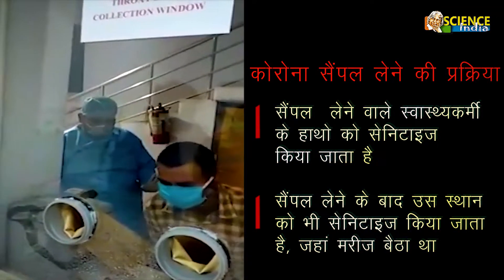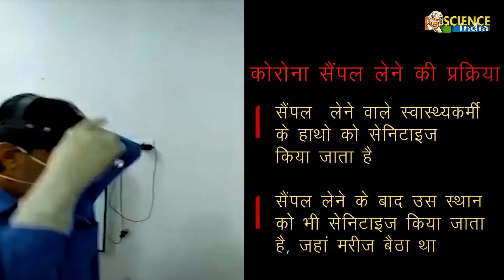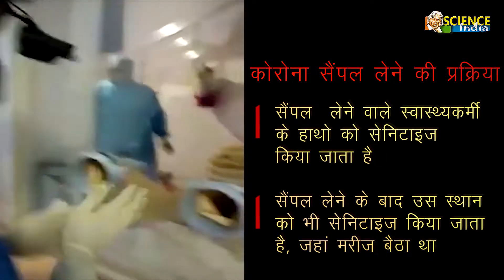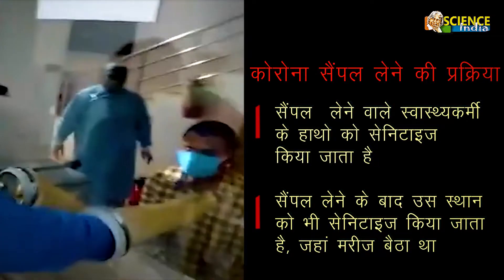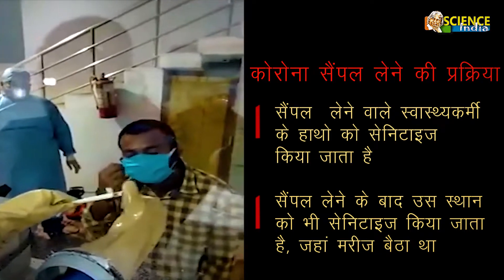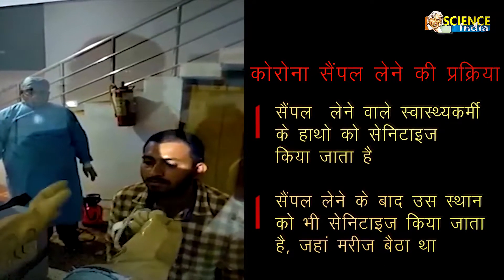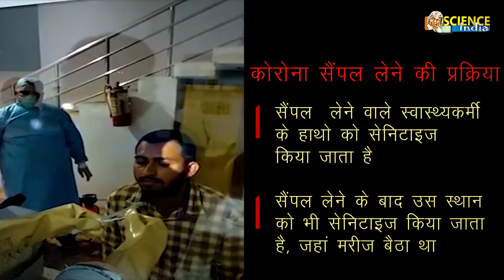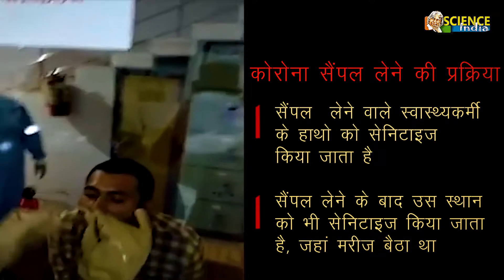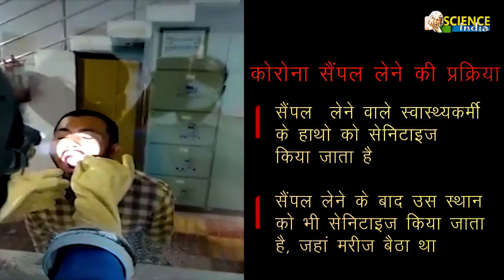Dr. Ravitanth is inserting his hands again through the glass plate. He has taken the swab and is removing it, taking it out. That is the swab with which the sample is taken from the throat.